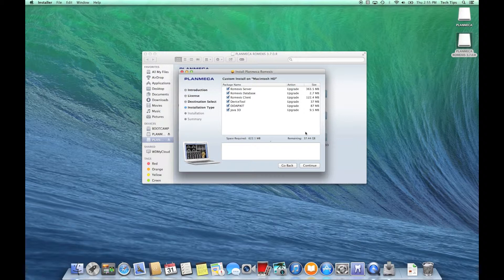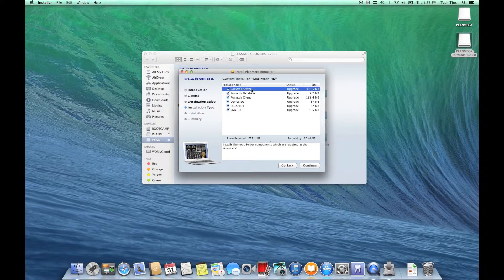First, let's break down what functionality each component brings. If I highlight any component, there's a description of what it does at the bottom. Right now we have Romexis Server highlighted, and the description says this installs the Romexis server components, which are required at the server end. So if I was installing Romexis and I wanted this computer to be the server, I would need to have this checked.